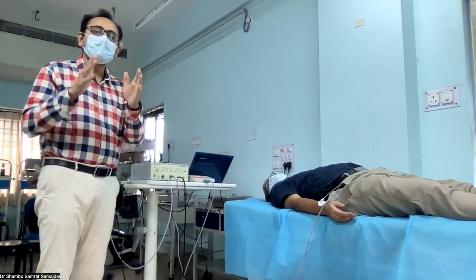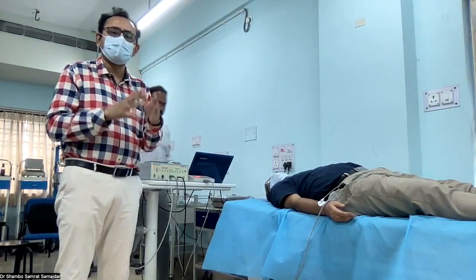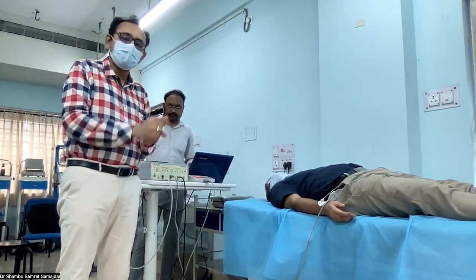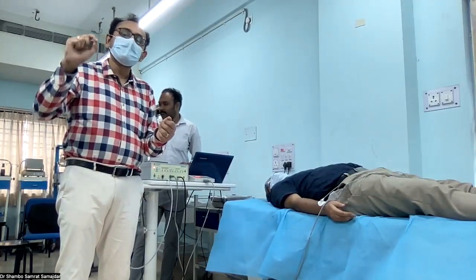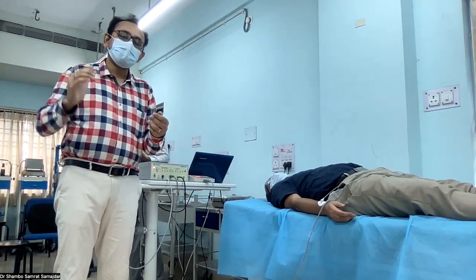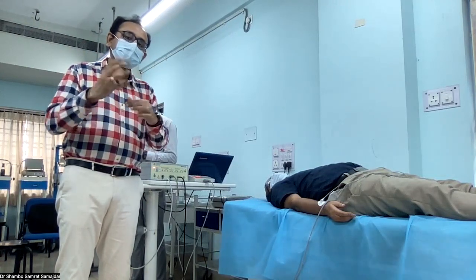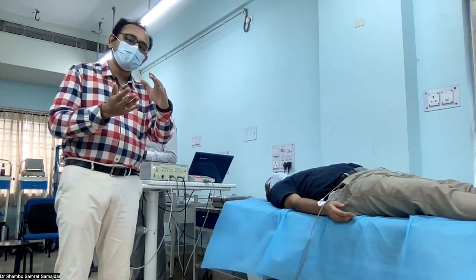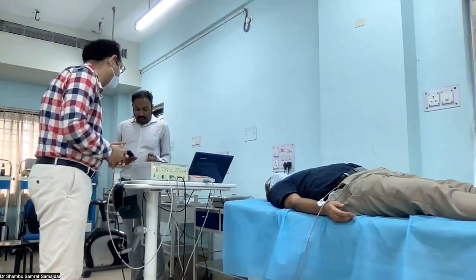So what is the high frequency wave? Generally, high frequency waves demonstrate parasympathetic nervous system function. Now coming to LF, it includes both sympathetic and parasympathetic nervous system activity. So when we take the LF by HF ratio, if the LF by HF ratio is going down, that means there is some problem in sympathetic nervous system activity, as HF is more here. And when it is vice versa, that means the HF value is low or the LF by HF value becomes more, that could be some problem in parasympathetic nervous system activity. Let's proceed to the next.